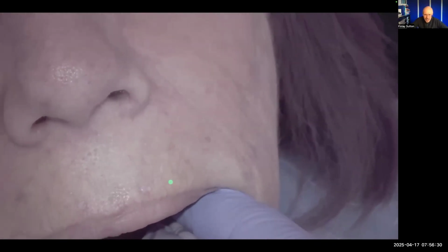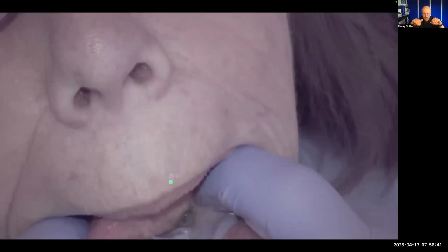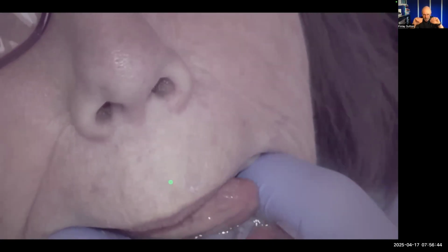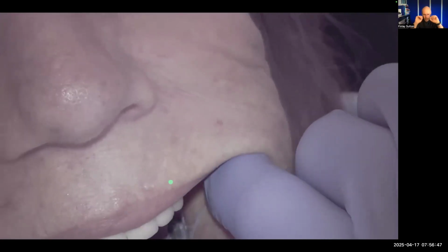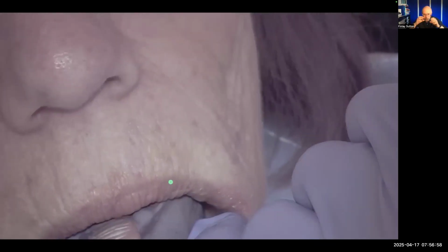And then I do my border moulding. The border moulding's important for those buccal areas there where we've got the free end saddles. I just take off some of the excess and then just push it down with my fingers, pressing down onto the premolar areas. I'm sorry you can't see that. But what Jackie's doing here, she's really moving her tongue. I wanted to get that tongue moved because I want to make sure that I've not overextended the impression on that lingual area and that the final lower telescopic bridge will not be restricted.